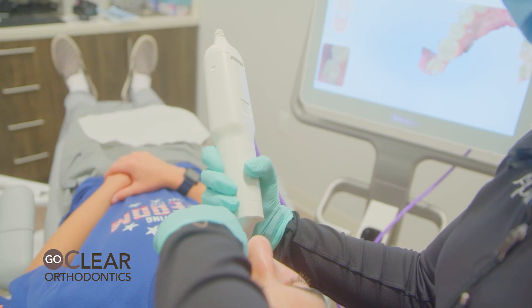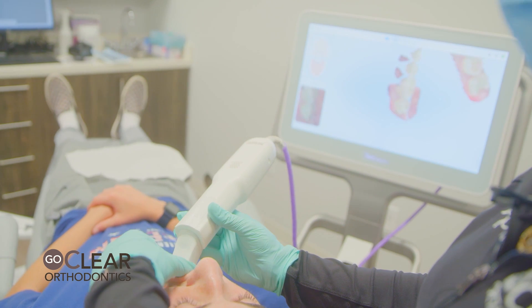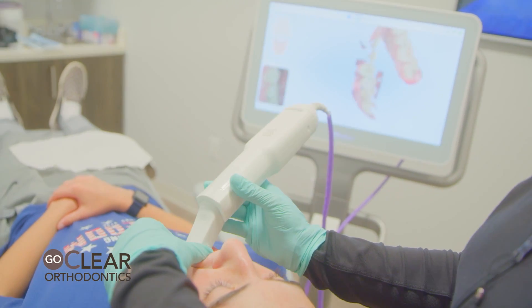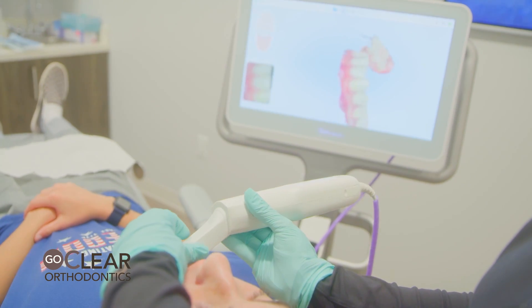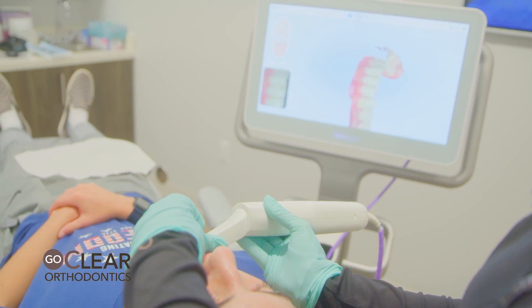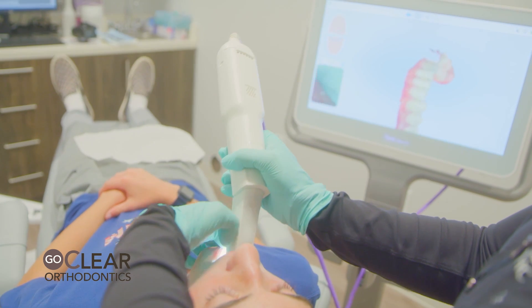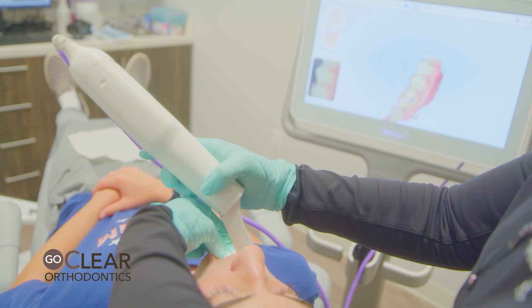Once I get to the lower left, I'm going to roll to the buccal. I'm going to hold my thumb on the wand tip and press his cheek and lip against the bottom. I'm going to walk with it to hold his lip out of the way, or you're going to fight with that lip and it's going to take you multiple attempts to get these lower anterior teeth. Once I get to the midline, I stop. I'm going to come back to the lower right, roll to the buccal, and again walk to the midline.